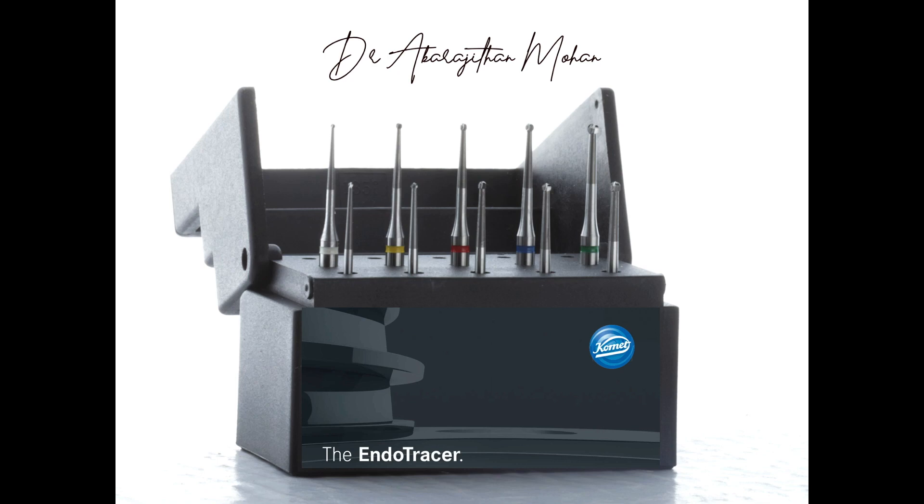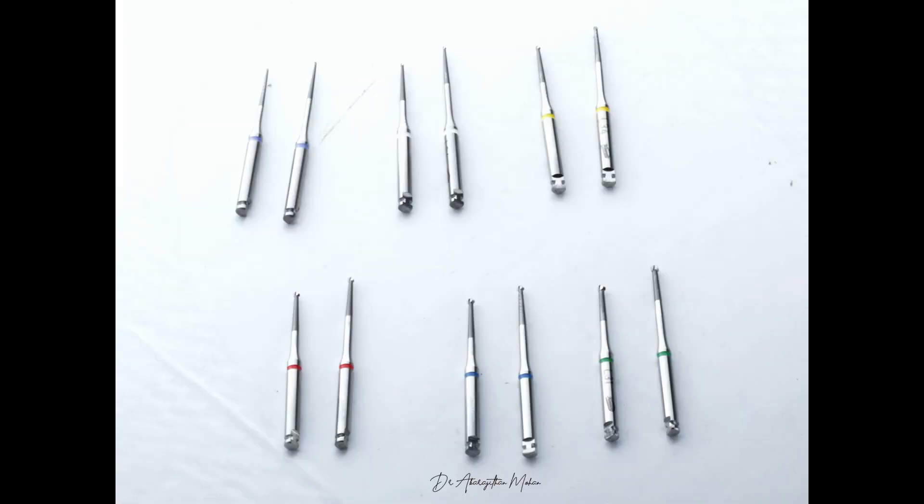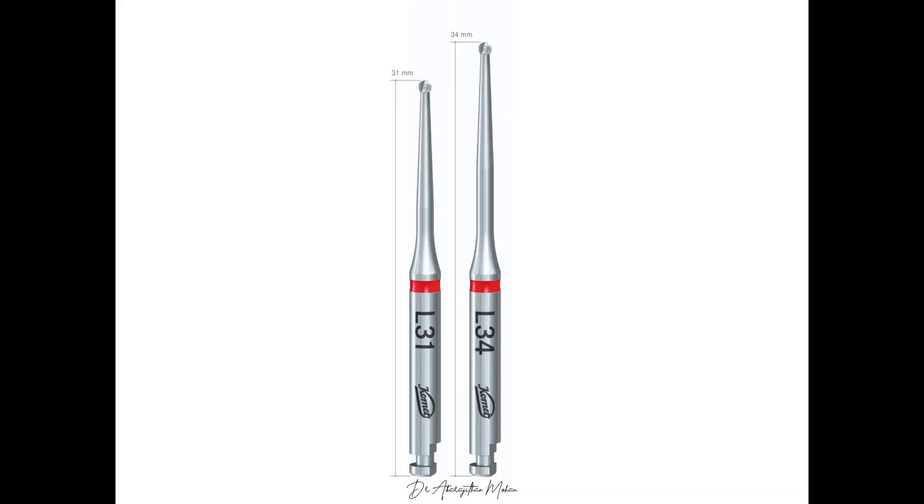Hello everyone, welcome back to Endotales from Life. In this video we are going to see the clinical importance of slow speed long neck burs in endodontics, and we are also going to do a product review from Komet, which is the Endotracer — a pack of long neck burs. When I say slow speed, they are meant to be used with a contra-angle micromotor handpiece. This package contains 12 different long neck burs with six different sizes.